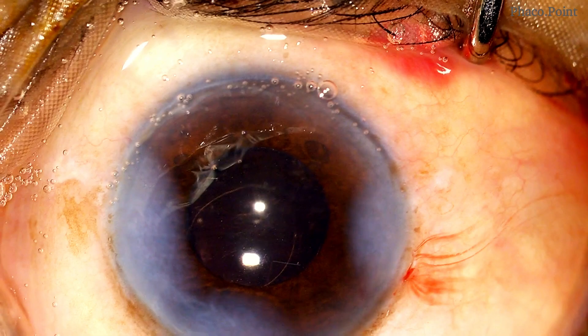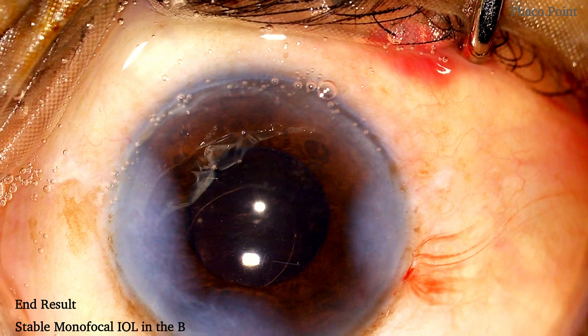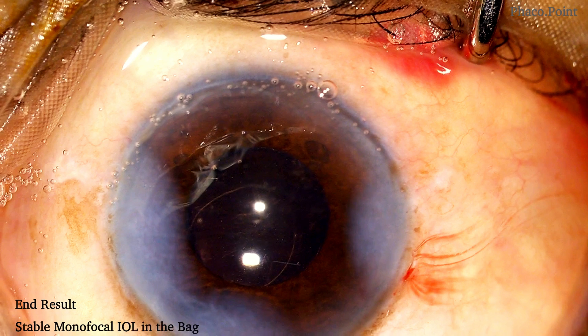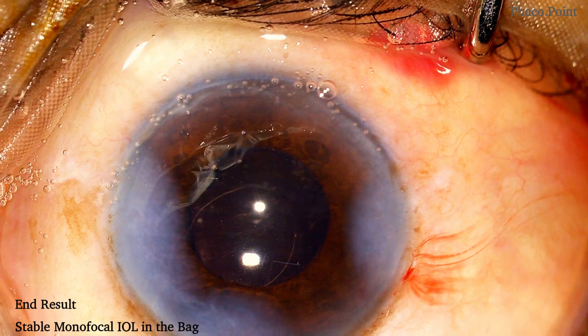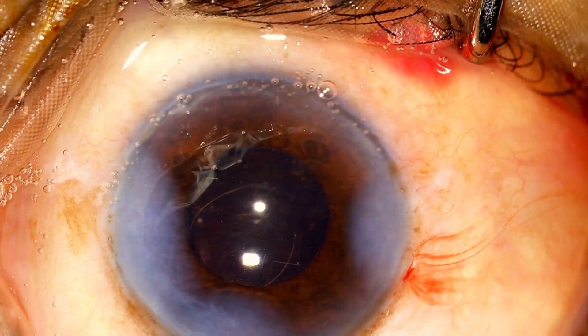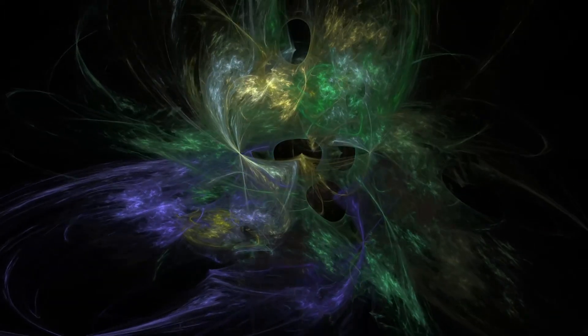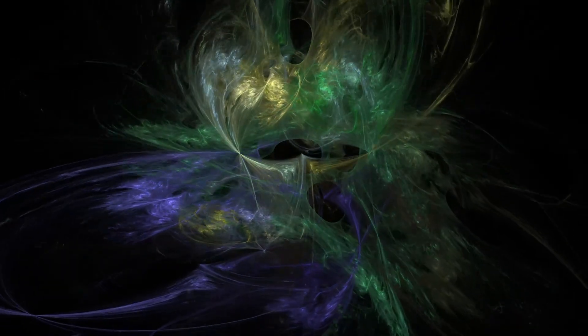This is the end result: a monofocal IOL stable and well centered in the capsular bag with the punched-out posterior capsular rupture. I do hope that you found this video useful. Thank you.